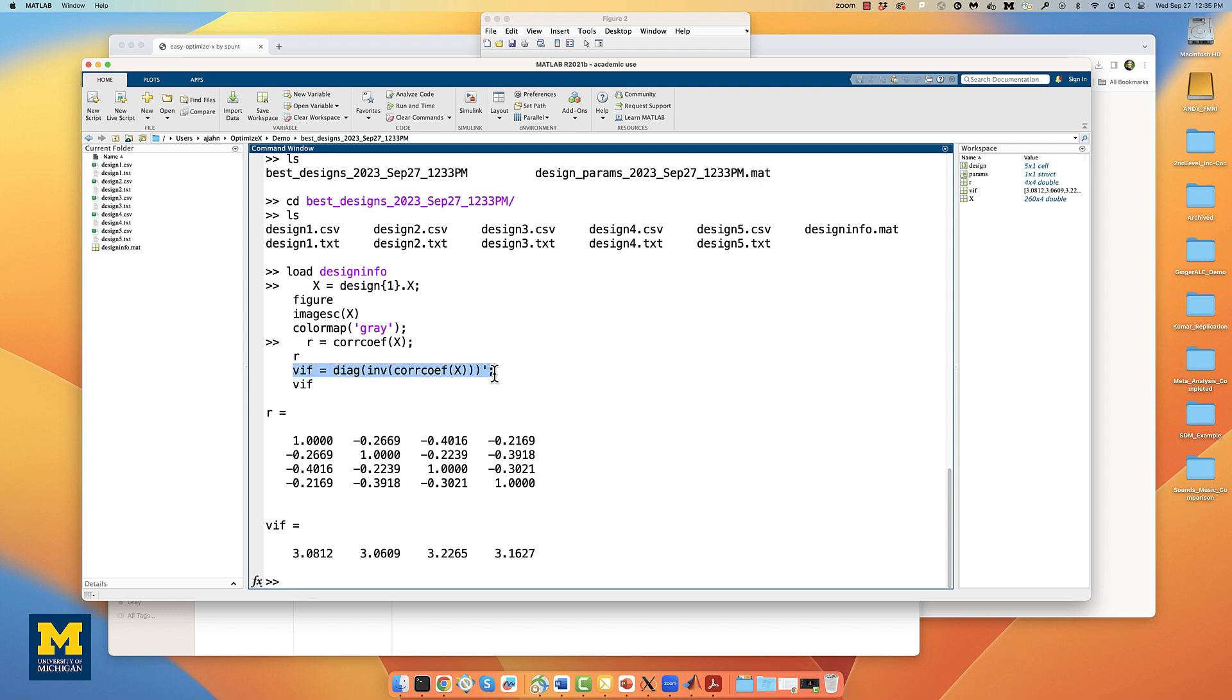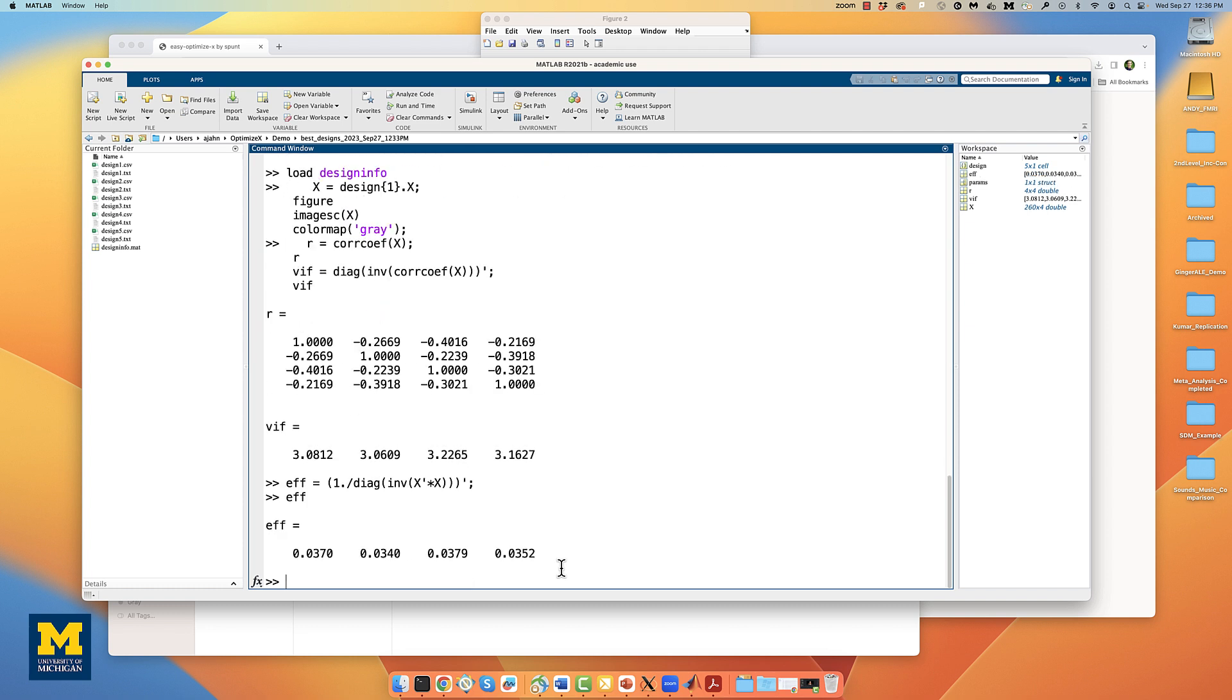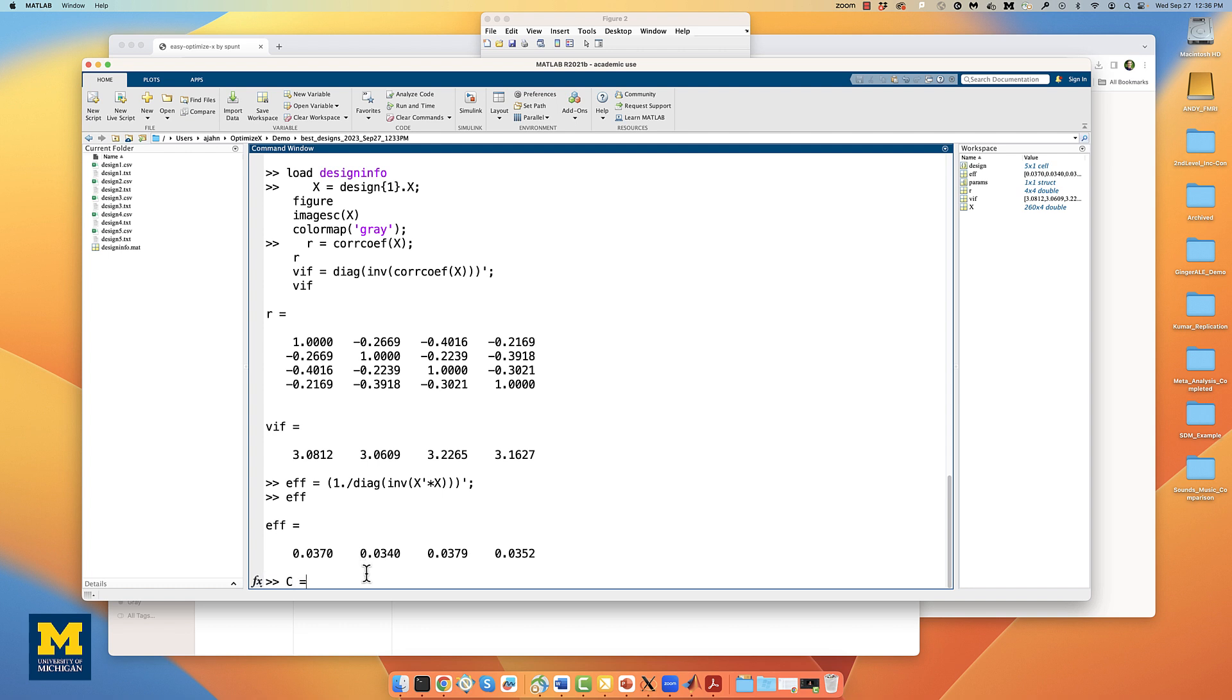This code also calculates the variance inflation factor, or VIF, which is a measure of how much the variance in each regressor is inflated due to collinearity. For now, however, we are most interested in the efficiency of the design. In particular, we want the diagonal elements of this matrix, each of which corresponds to a predictor in our design. This code will calculate the efficiency, and notice that these numbers are unitless measurements and can only be compared to other similar designs. While higher efficiency for each regressor is a good thing, what we are typically interested in are contrasts.